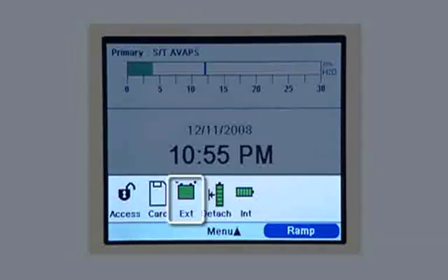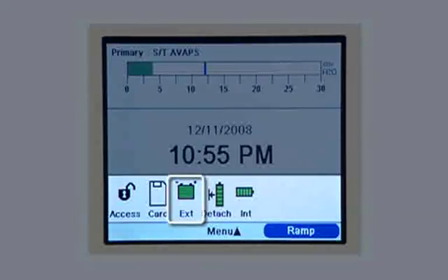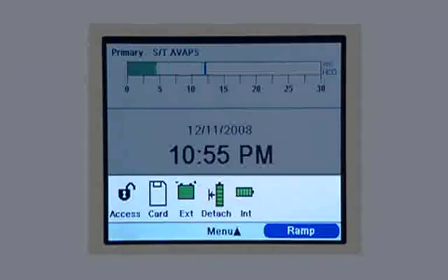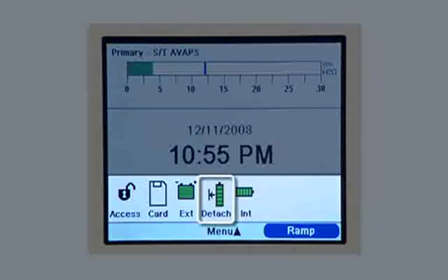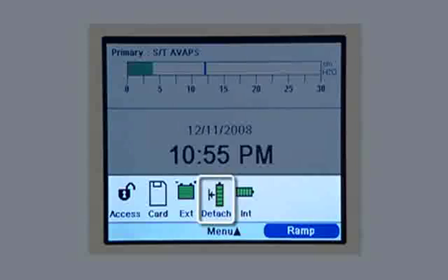When the symbol is green, the battery is fully charged. The level of the green shading will go down as the battery charge decreases. You know the detachable battery is in place when you see its symbol. The amount of green shading gives you an idea of how much charge is left in the battery.